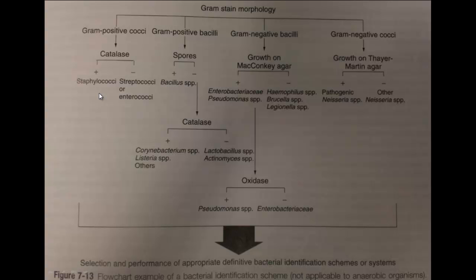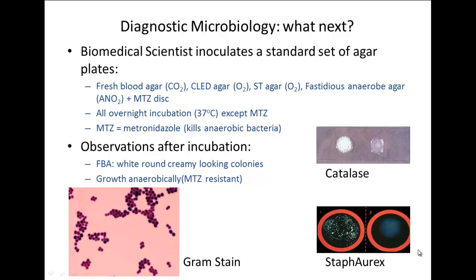This chart only provides genus-level identification, so we may choose to do another test. We will do a coagulase test — this is a commercial version called the Staphorex test. It tests for protein A, a protein that Staphylococcus aureus produces, and for clumping factor, which allows S. aureus to coagulate plasma. In this test, the test strain emulsified into the reagent has gone all clumpy and grainy — a positive result — compared to the negative control. So we more than likely have Staphylococcus aureus.